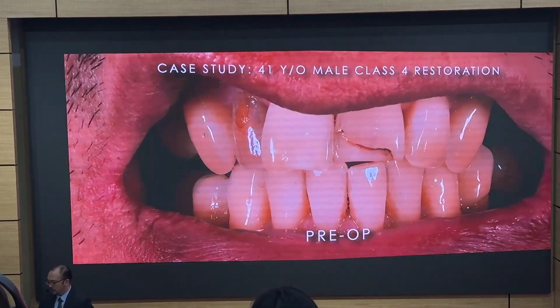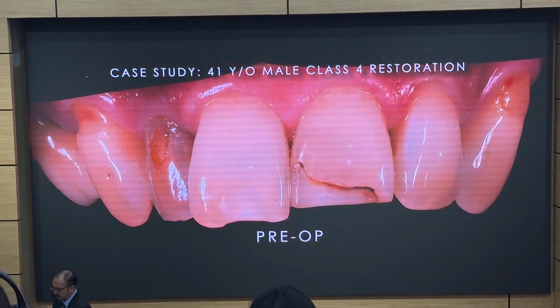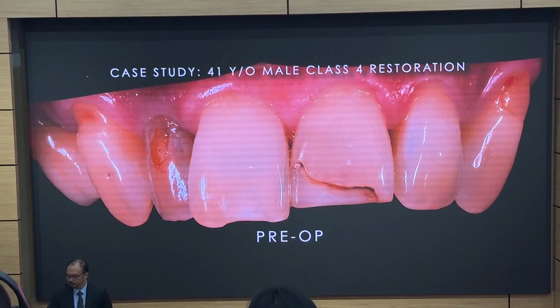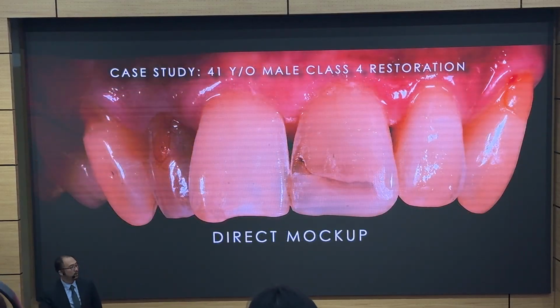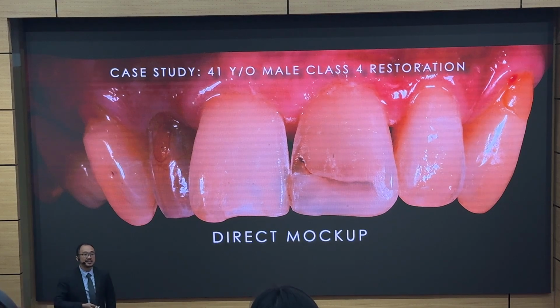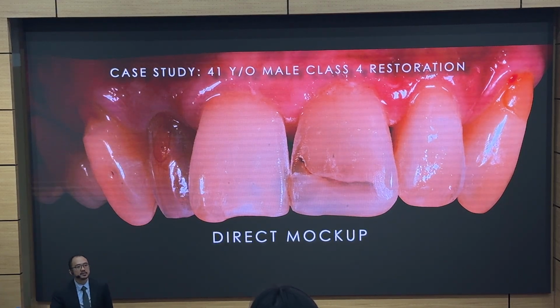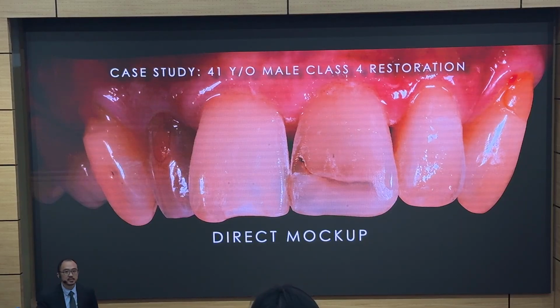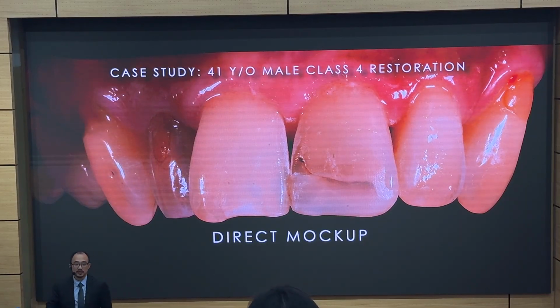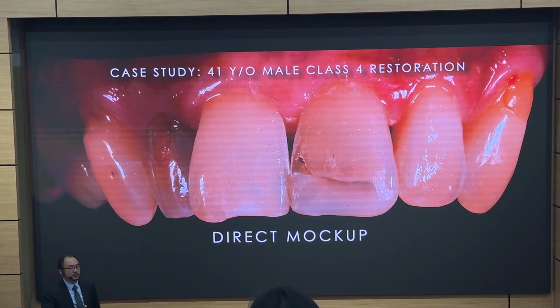Yeah? Another case, as an example, I can't remember this student's name, but this is pre-op. This is the mock-up. To show the gentleman, is this okay? Yes. So my point is that if you have expired composites in your clinic, don't throw them away. This is very helpful.